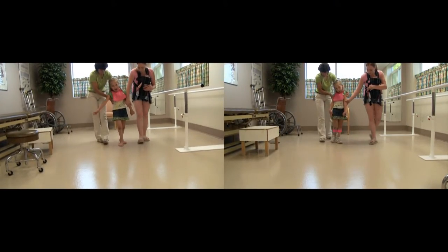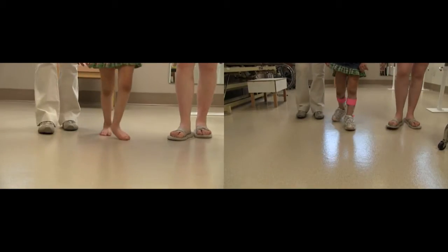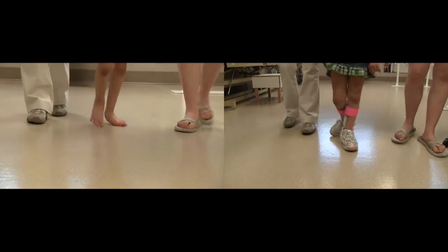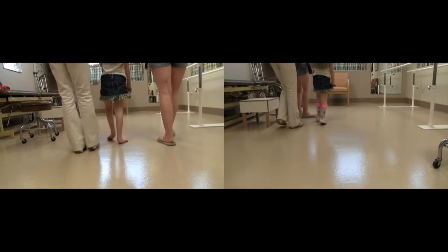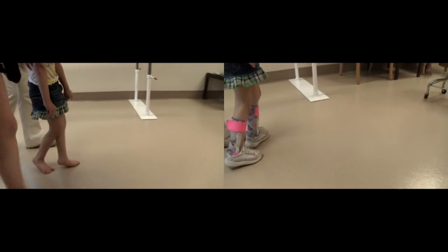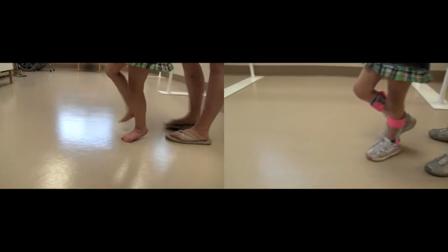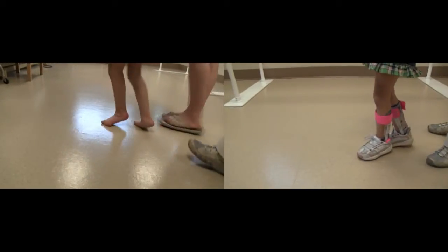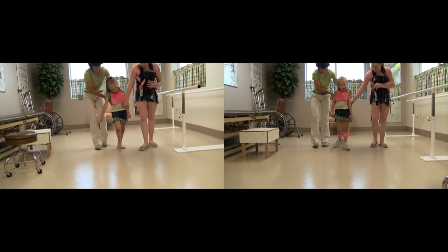Here again, you can see Summer walking with the braces, and she is much more stable now with the bilateral DAFO number twos. She actually walks with a very flat-footed gait, very symmetrical. Summer is able to advance her legs forward much more easily now that she's a little older, and it takes a lot less effort in getting her to ambulate. She is more relaxed even in the upper extremities just by having her feet controlled in a better alignment.